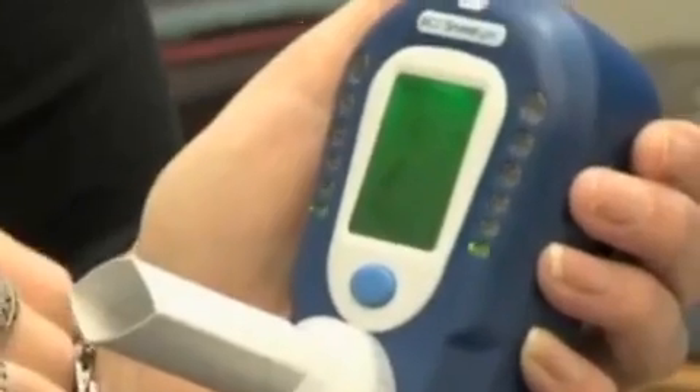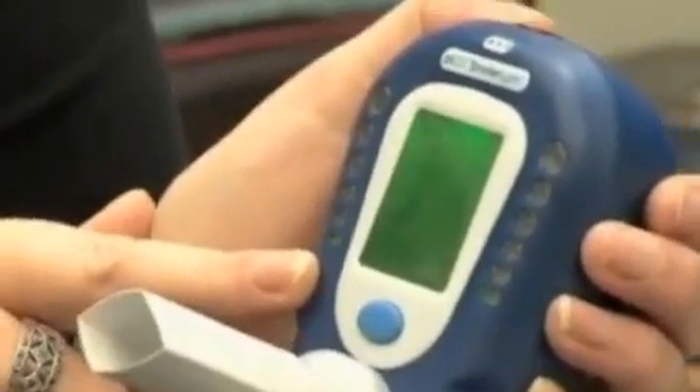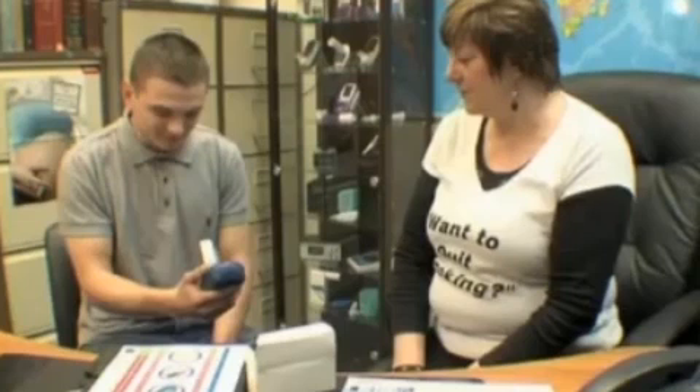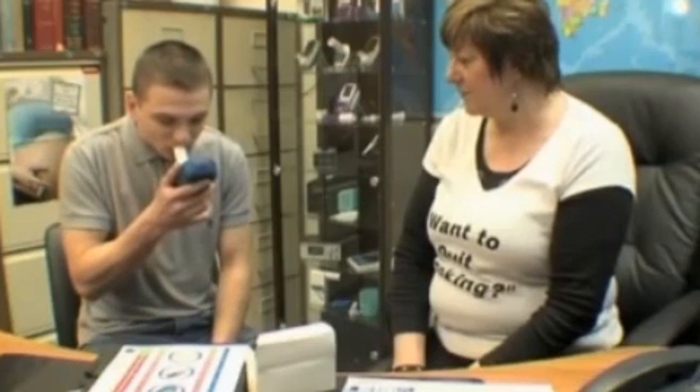The Smokealyzer range is the easiest to use and most effective CO monitor available, allowing healthcare professionals to accurately prescribe stop-smoking therapies such as nicotine replacement therapy, and judge when a smoker has successfully stopped smoking. The monitor also helps motivate smokers to stop.